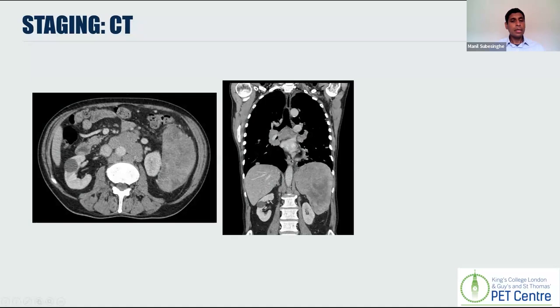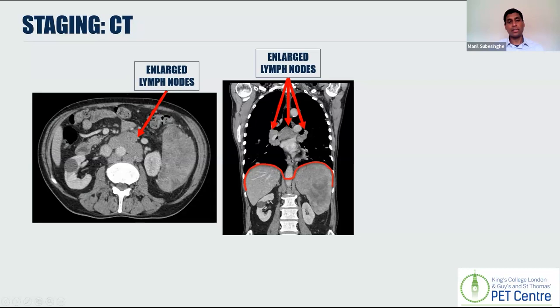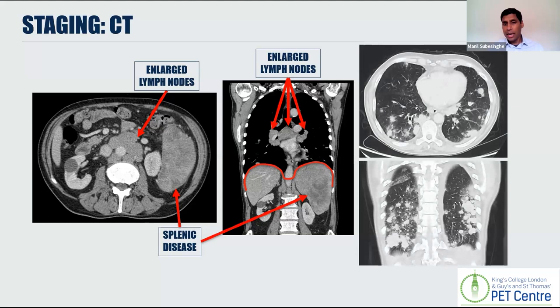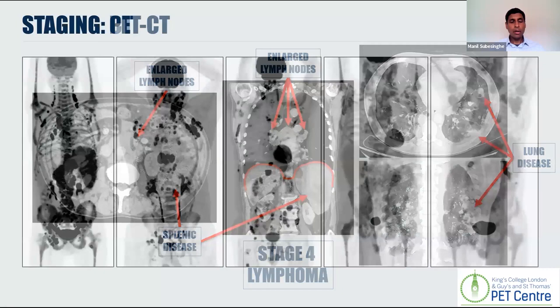Here's an example of a CT scan used for staging. We've outlined the diaphragm, and you can see the kidneys just here. There are enlarged lymph nodes at the level of the kidneys, which are beneath the diaphragm, and there are enlarged nodes above the diaphragm within the chest. So we are already dealing with stage three lymphoma. You can also see that the spleen is abnormal — it's enlarged, and there are dark areas of gray in keeping with lymphoma. If we look at the lungs, which generally should be black, there are white nodules which are also sites of lymphoma. So this is a person with stage four lymphoma.